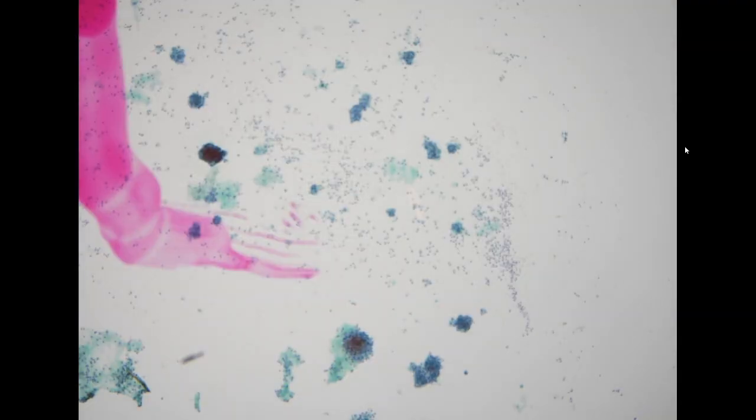The next specimen is from an ascites specimen. This specimen is relatively challenging. The patient is an 89-year-old female who had a past history of hepatocellular carcinoma and underwent multiple TACE. In this current presentation, she had shock and was suspected to have HCC rupture.